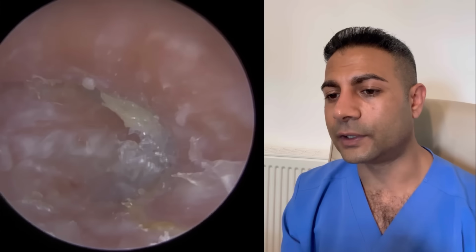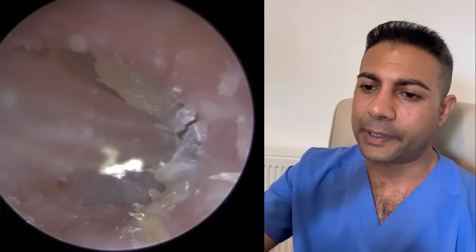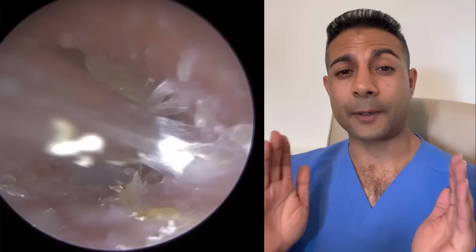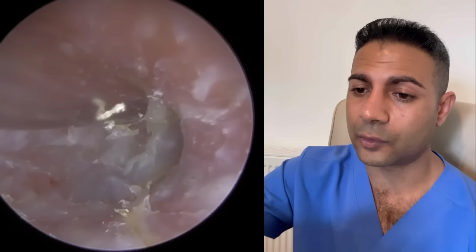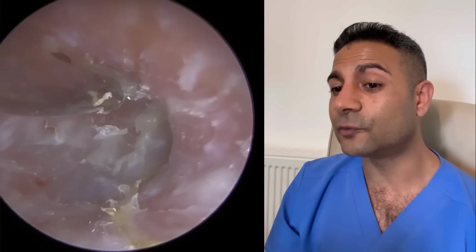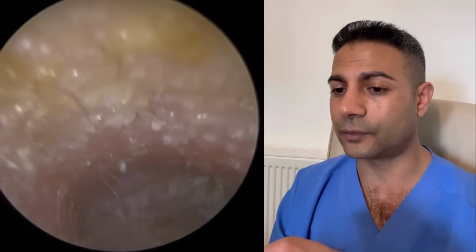I'm actually holding the endoscope slightly differently for this patient. So I'm holding it more horizontal. If I was to examine this patient's ear with them sat upright like I am right now, you would need to rotate the view that you're getting clockwise by 90 degrees. So although the patient wasn't lying down, the appearance of the eardrum does look like they're lying down with their head back because of the way I was holding the endoscope.